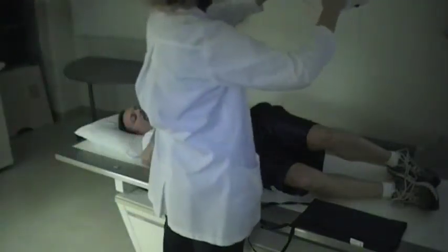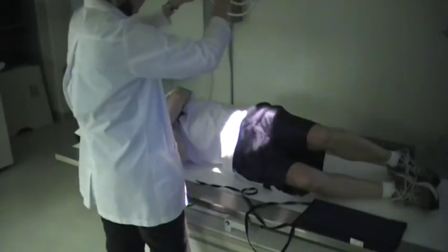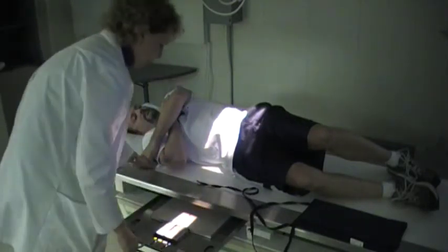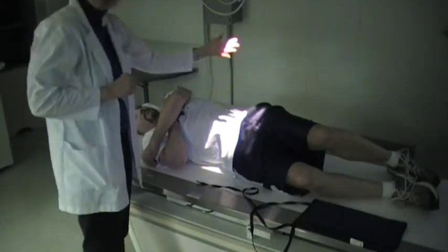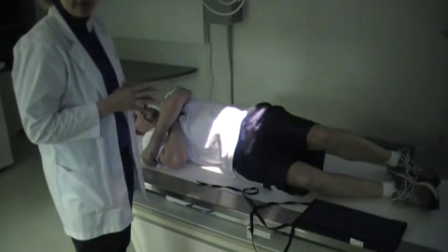It will be a straight central ray. When you're imaging SI joints, you're imaging each joint separately. Because his left side is up, we're going to be seeing the left SI joint the best.